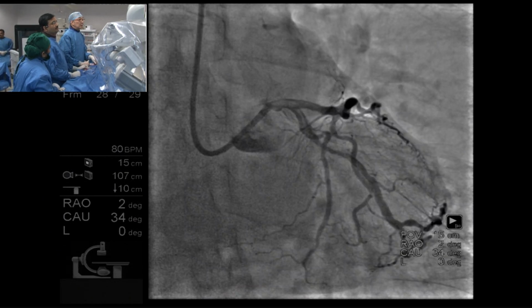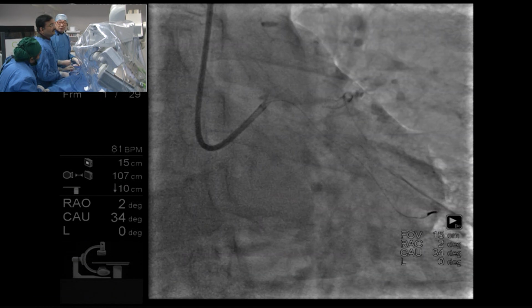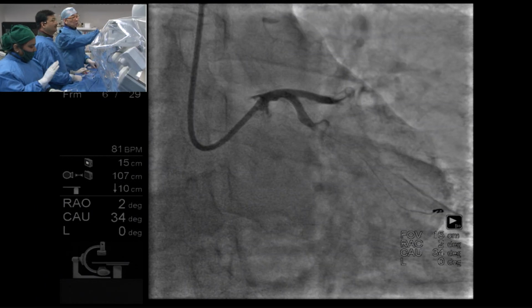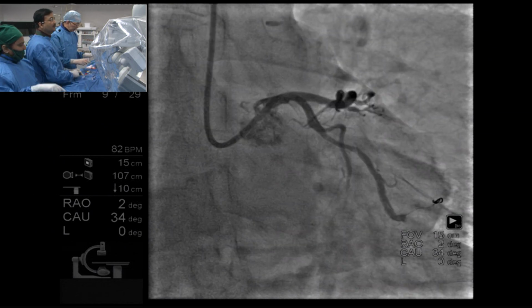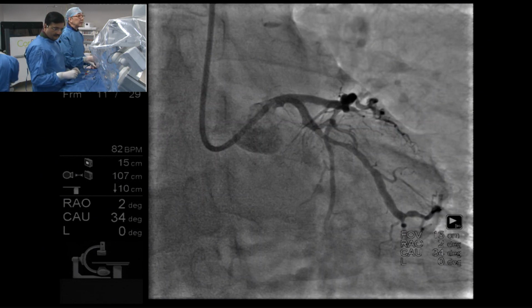A little bit smooth, this one. I think it's another 30, 24 or 28. 28 is okay, right? 32, from normal to normal. Okay, fill 32, as Sanjay suggests. After that we IVUS it. You don't want to pressure wire it? I think we just direct stent this one.